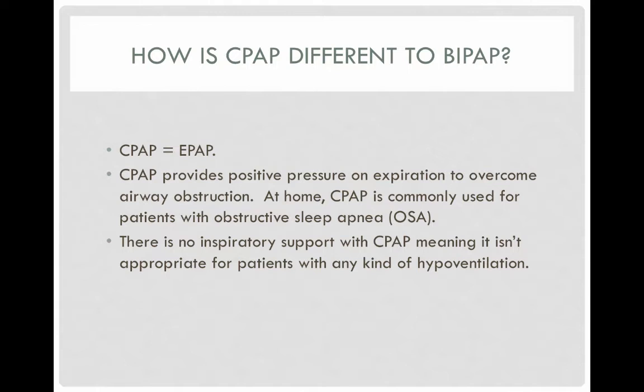So what's the difference between CPAP and BiPAP? CPAP is really just expiratory positive airway pressure. Again, CPAP stands for continuous positive airway pressure, meaning that it's a continual amount of pressure when the person's breathing in and out without any added support to them when they inhale.